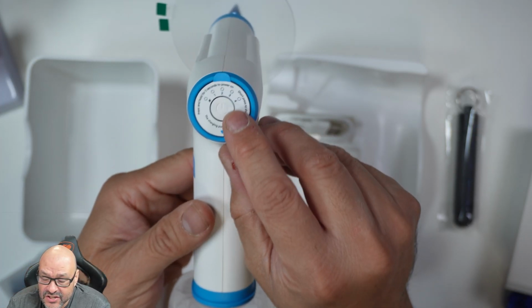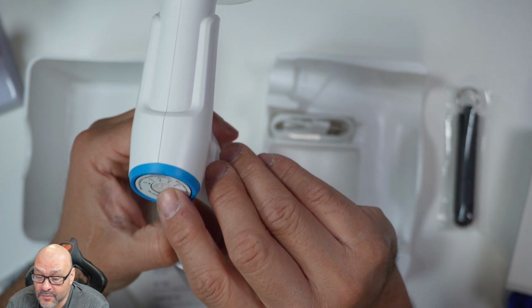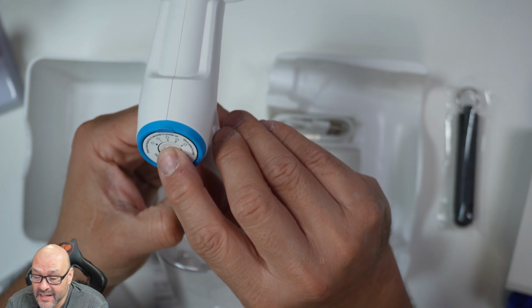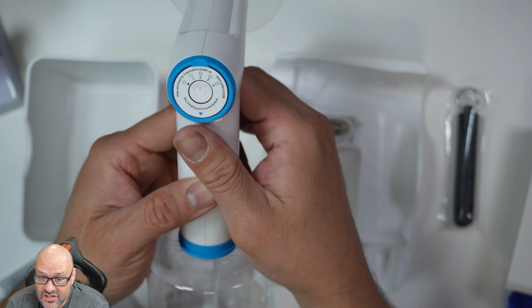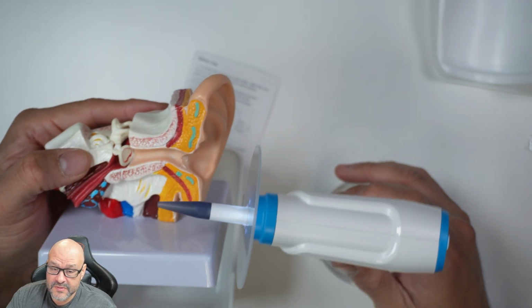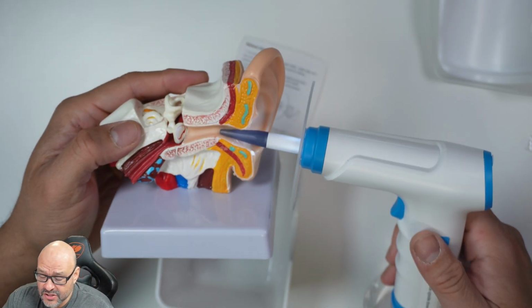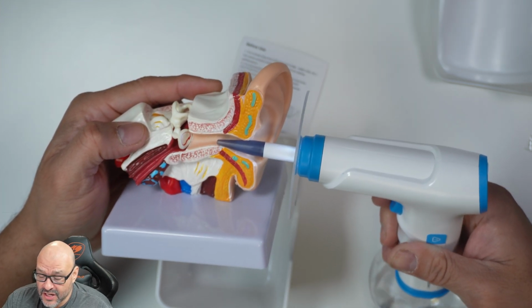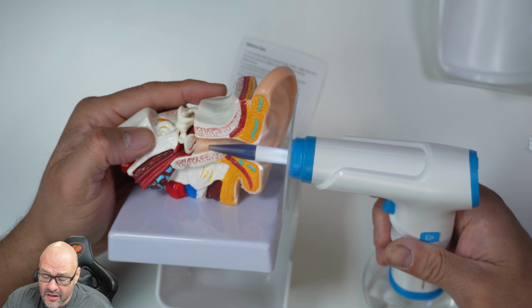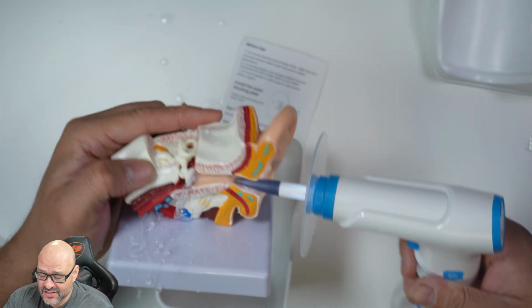So to change it, you just have to hit the button twice, real quick. So right now we are in number 2, number 3, number 4, and we're going to go to number 1, which is the slowest one. All right, for demo purposes, so you guys can see a visualization, I have a model ear here, and I'm just going to show you how much it works. So we're going to see if we could tilt it and see how deep. Don't put it all the way in, put it in here pretty much, and you hold down the button and it starts leaking. So let's take a look at the actual modes, all right?